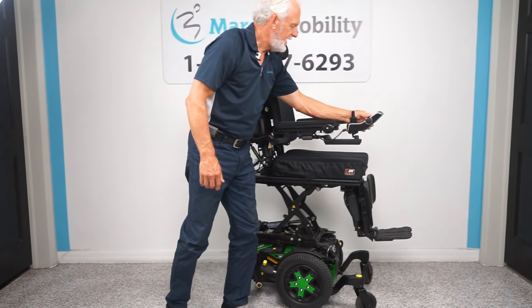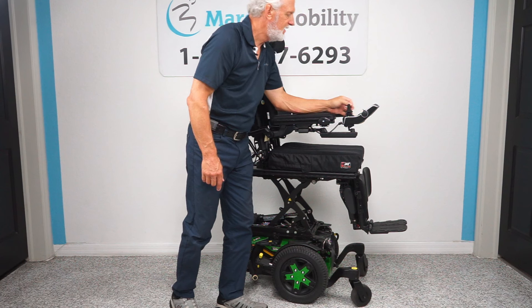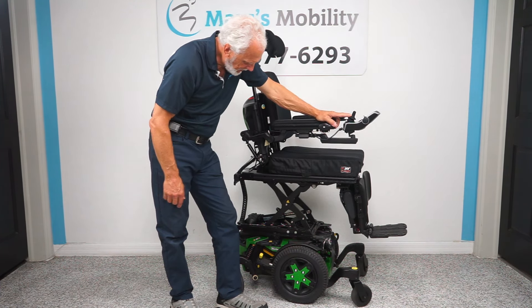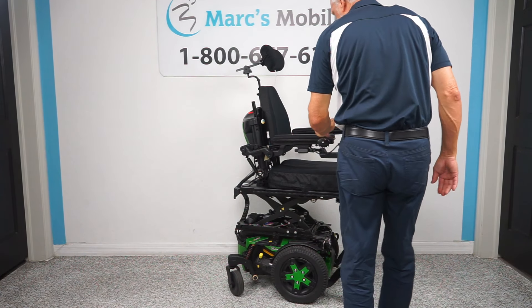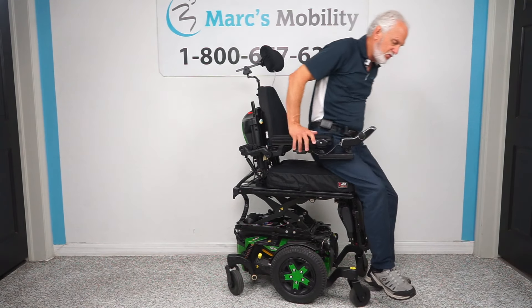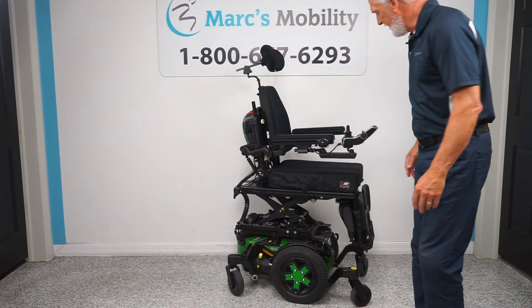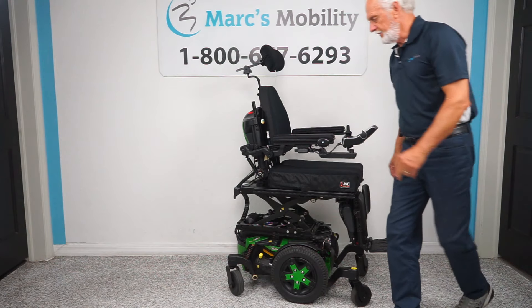We turned the power off to put it in neutral, so now we're turning the power back on and going back to bring the seat down. If you have someone who has trouble getting out of their chair, the nice thing about this chair is if you leave the seat elevated before you get out, all you have to do is push yourself here and you're out of the chair. So if you have a loved one you need to help out, it's a lot easier with the seat lift.